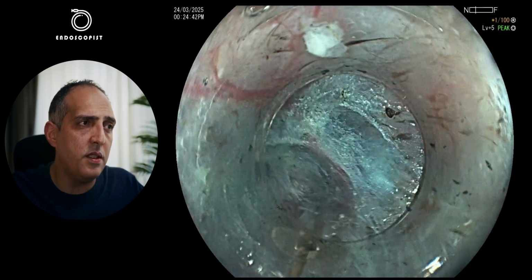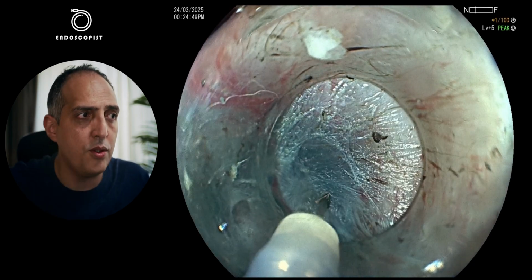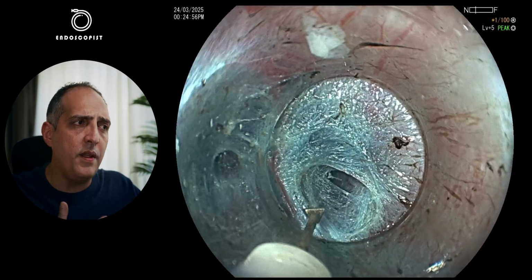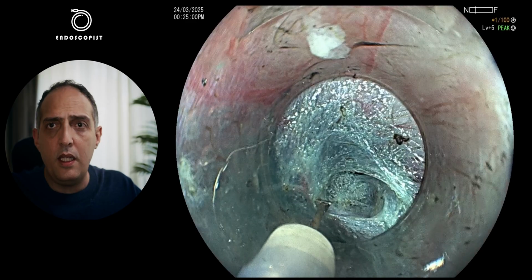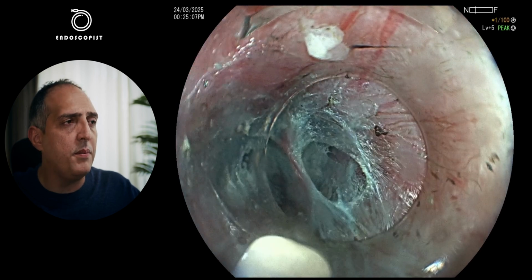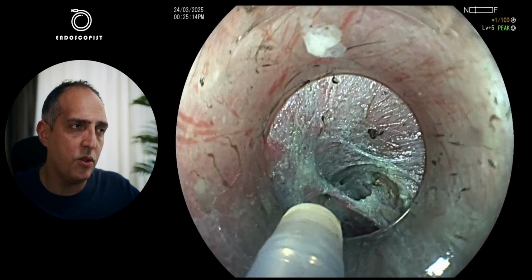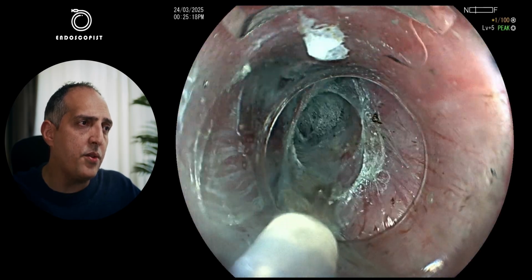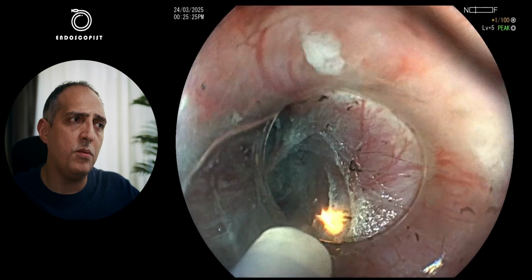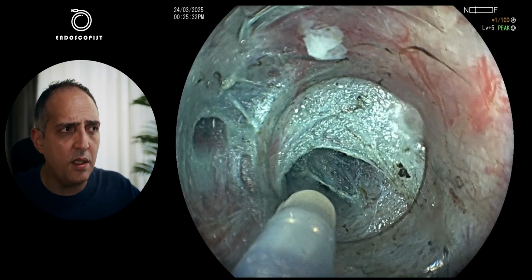We can see here the first penetrating vessel. Once you see the penetrating vessel, you go to the right of this. Of course, I'm doing a posterior myotomy, so I go to the right of the penetrating vessels. Again, it is my own belief that you don't have to do it. Even in the studies, some data will show that it is beneficial to leave the sling fibers intact, and some will show that there is no big difference. As you can see here, I'm trying to open the space to the right of the two penetrating vessels. Of course, it will consume more time if you use this approach. Here, it took about 2 or 3 minutes extra for the procedure, but it is not a big deal.